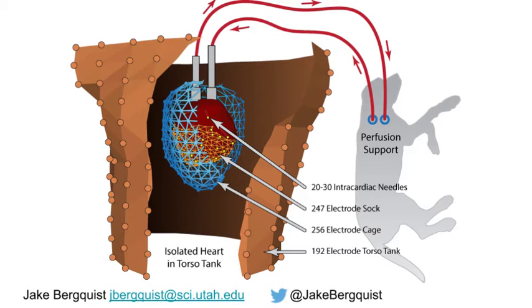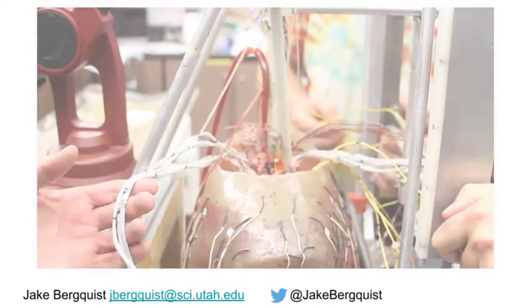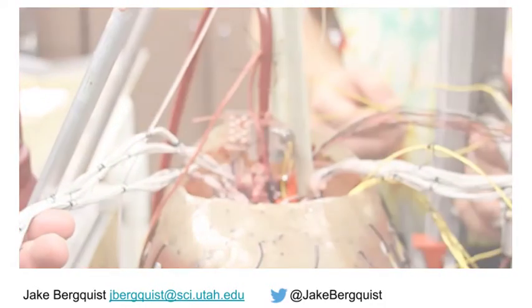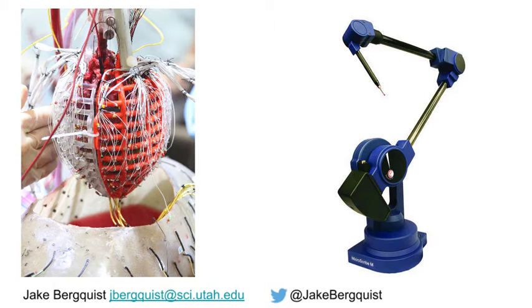In order to correct for geometric errors, such as the position of the heart, again we turn to the pericardiac cage. Because it is rigidly fixed within the tank, registration of it is as easy as digitizing the locations of each of the electrodes. This is done using a mechanical digitizer.